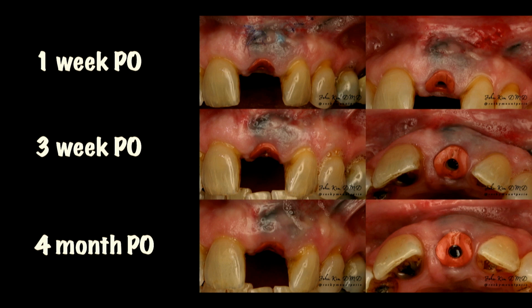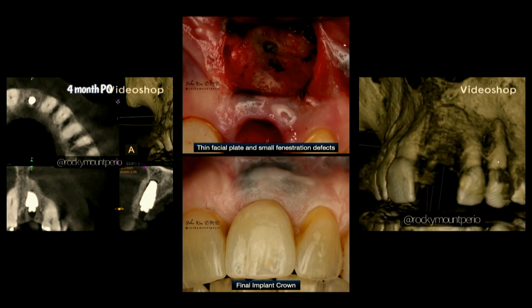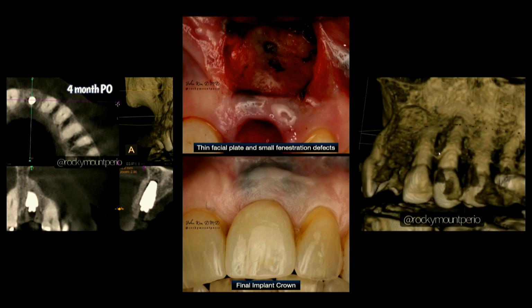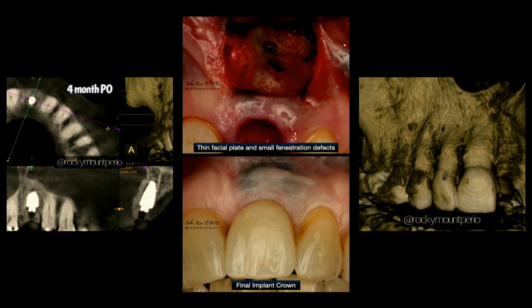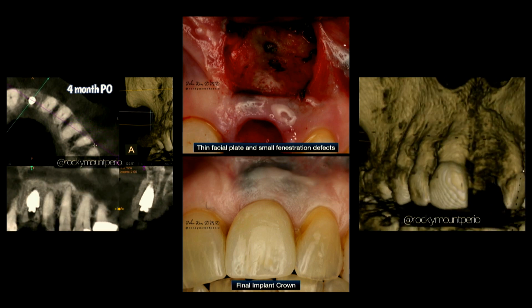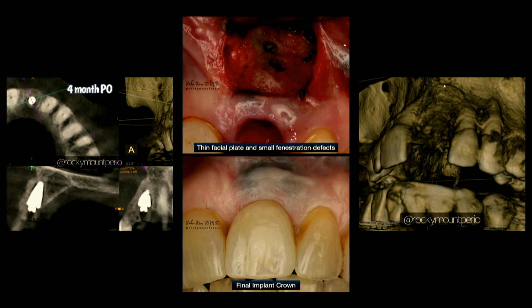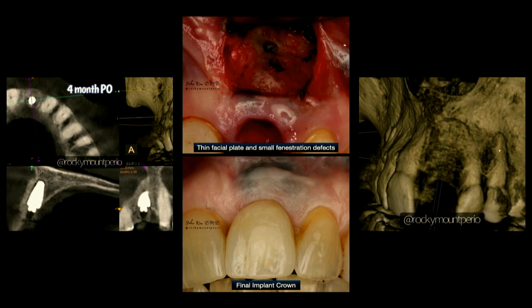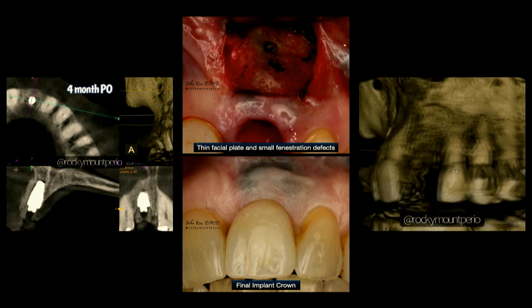Was able to maintain a good soft tissue profile and good keratinized tissue and maintain a good level of the marginal tissue. But what is happening underneath here is what I like a lot when you see the CT scan. With the 3D rendering and the CT scan that you see on the left, what you can see is that we not only had the fenestration defect covered, but we had a gain in the facial bone of a few millimeters, I believe, when it was really thin before.